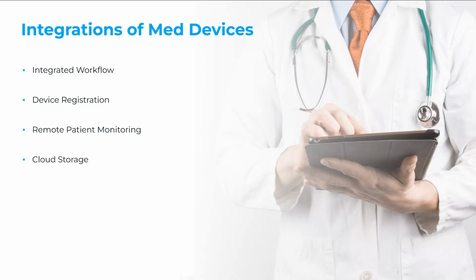Remote patient monitoring. Again, this was a topic on a previous webinar as well, but this is monitoring the patient's vitals or other parameters. Like you could do continuous glucose monitoring and things like that. And the patient's not coming in. There is a device that's monitoring their glucose. We even have some that will check your eyes for diabetic retinopathy as well.